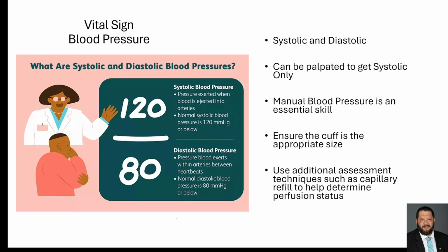Get a listen for that, and once you hear that, you're going to continue to inflate the cuff until that sound goes away.